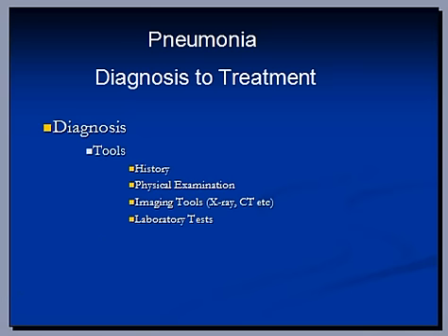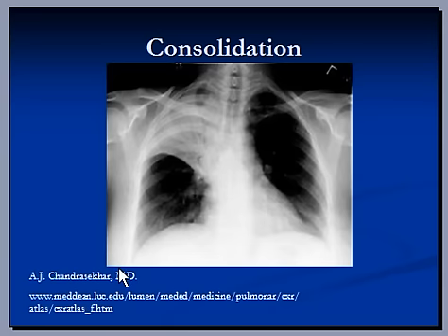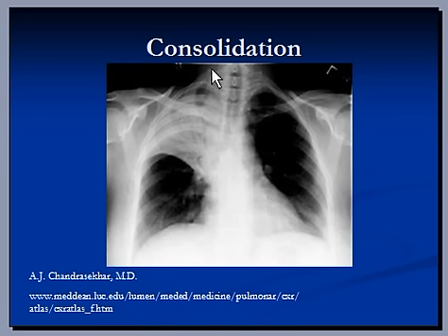The first picture shows consolidation in the right superior lobe, and you can also see air bronchogram. These black lines are bronchial branches that have air in them, and they are visible because of consolidation in the background. The background is opaque and the bronchial branches have air in them, which is why they are visible.